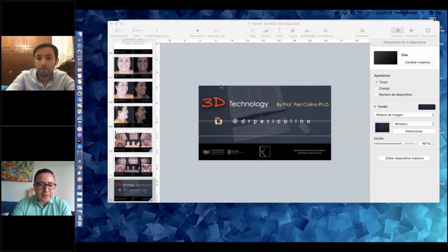I guess someone here still has a question. How do you decide to do a removable or traditional expander? So I think you answered that question. You go pretty much, I think over 90%, fixed. You don't do any removable expansion. Exactly.